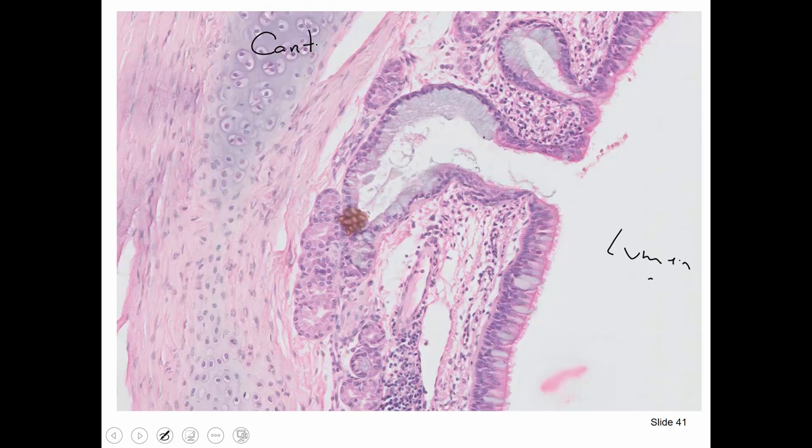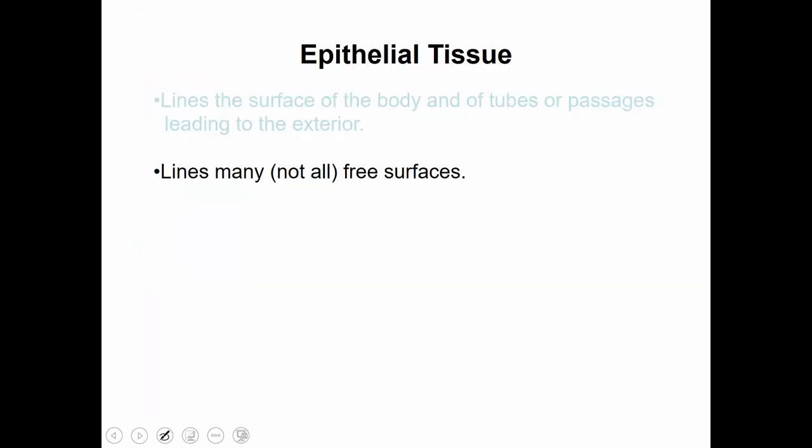And sometimes you see these little projections on the apical surface. Those are structures we will talk about. Those are apical projections, and you have to know what they are. But what I also like is if you go down here, look how this surface invaginates. You see that? Because when we talk about glands, exocrine glands are glands that secrete the product into a duct and makes its way out into the lumen of the bigger cavity. So if this is the respiratory tract, we have glands down here that are continuous with this ductal system out here. Okay? So now you're starting to put together different features.